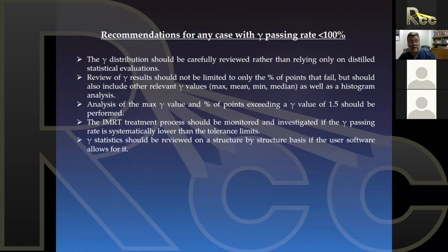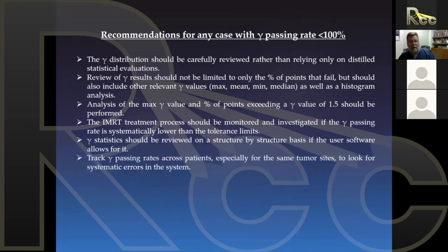The gamma statistics should be reviewed on a structure by structure basis if you can. We are unable to do this at this time at Fox Chase. Depending on the software that you may have or may not have or may be getting, you may be able to do this. And once again, track the gamma across known patients, same type of patients, same tumor sites, to look for systematic errors. So this is always a very good idea.